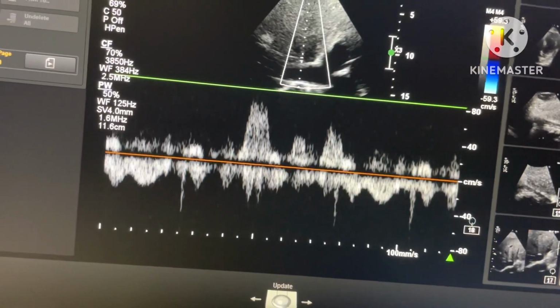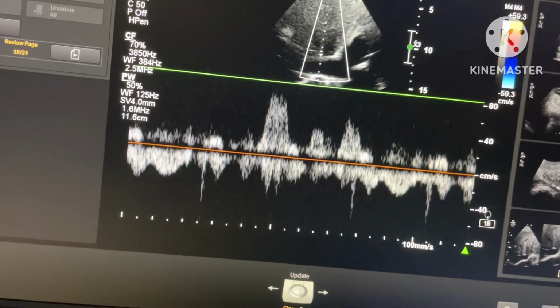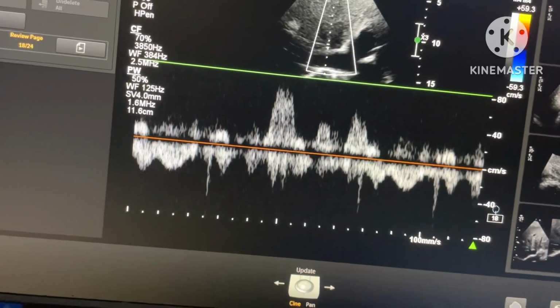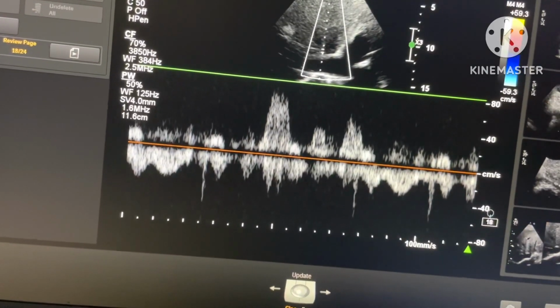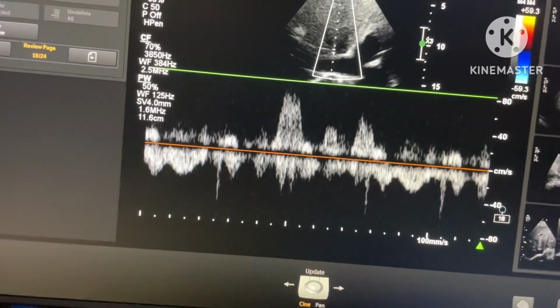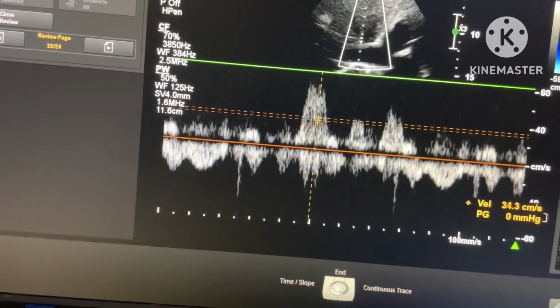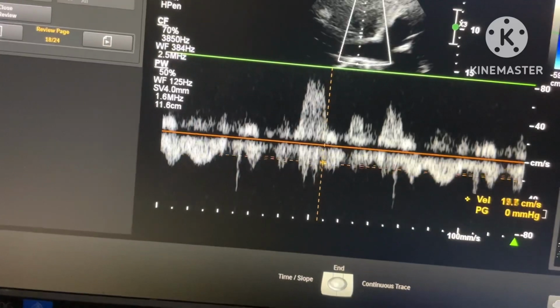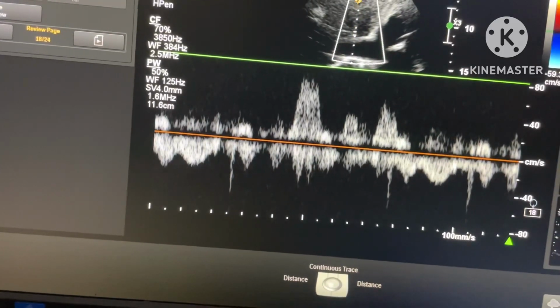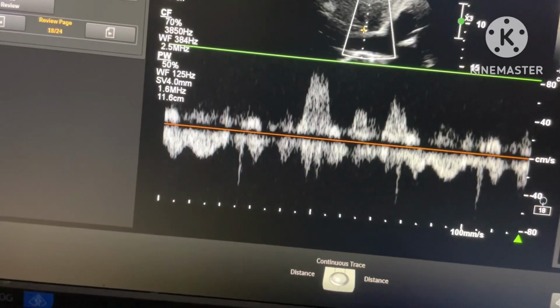You will find in this case expiratory diastolic flow reversal in the left liver mid-hepatic vein, seen at the beginning of expiration. That is the point to know. Whenever expiration begins, just see here, this is the part where you see the maximum diastolic flow reversal. The reversal flow is above the baseline, and normal flow is below the baseline, because in this image the hepatic vein drains into the IVC, so the normal flow is downwards, below the baseline. Reversal is above the baseline.